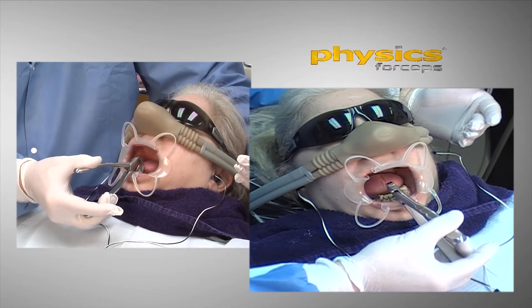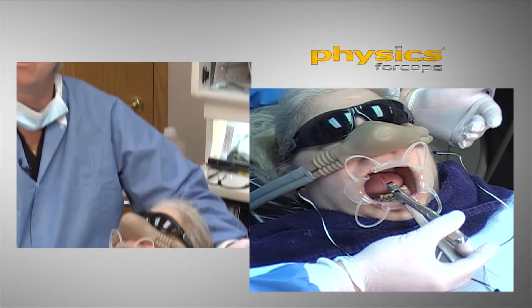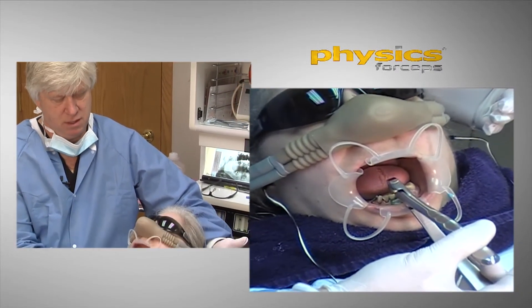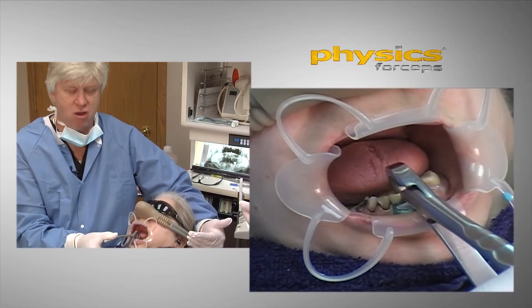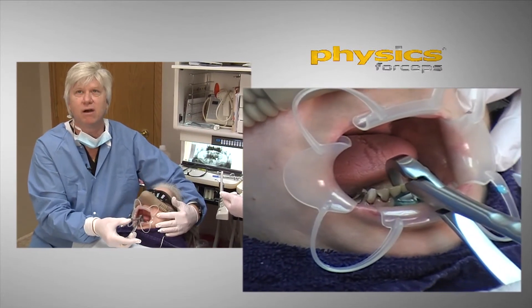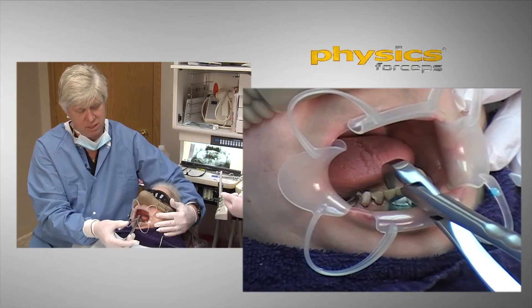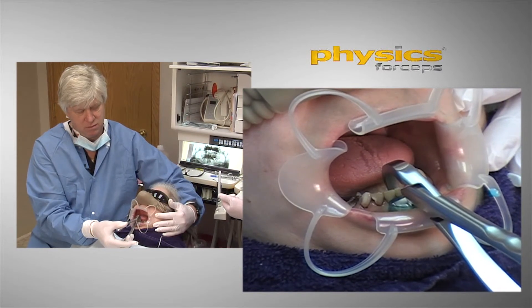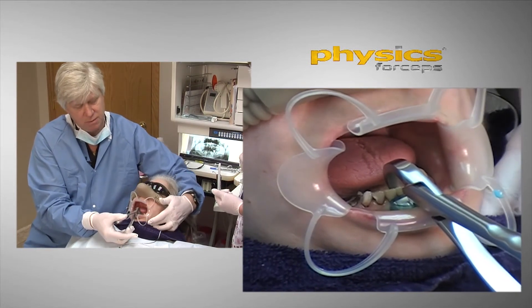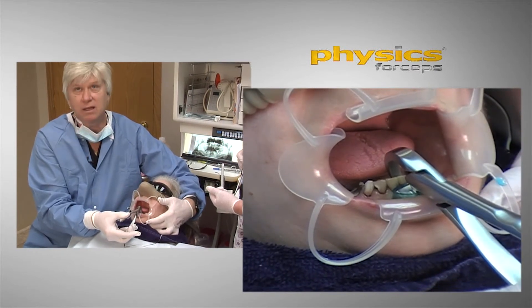I'm rotating my wrist towards the facial. I'm not using this like a typical forcep, so there's no force here. I'm rotating — it may take a minute, and that's a long time for a dentist. You can see the tooth, and I'm just rotating my wrist. Got to take your time here. Can you lift your chin up just a little for me? Not really putting a lot of pressure at all.